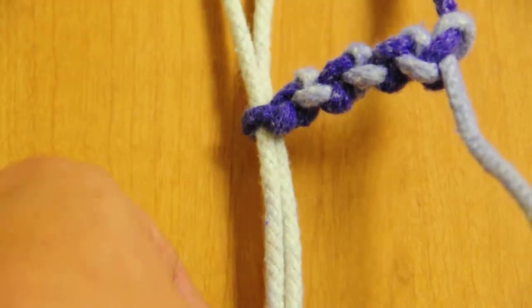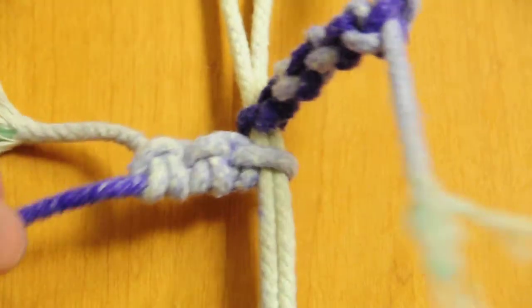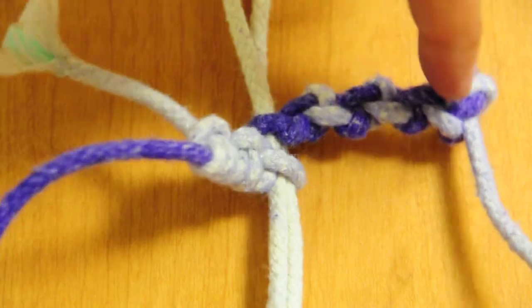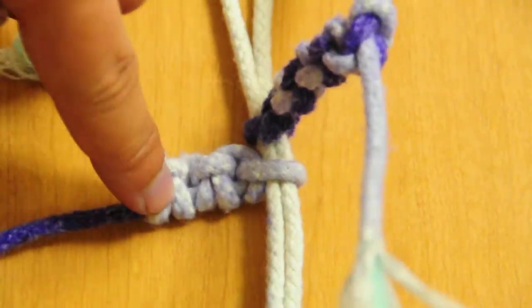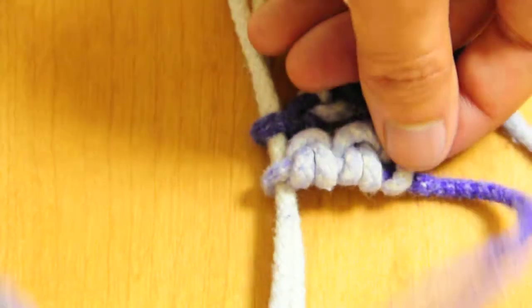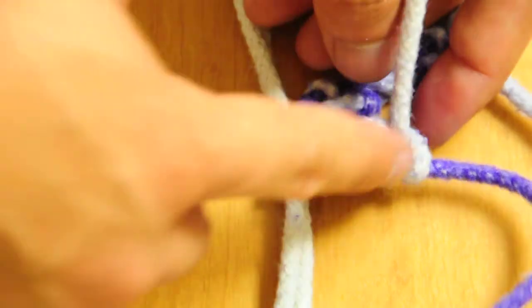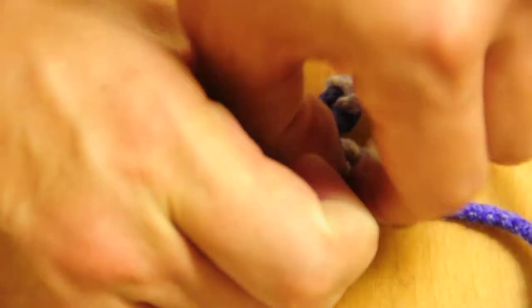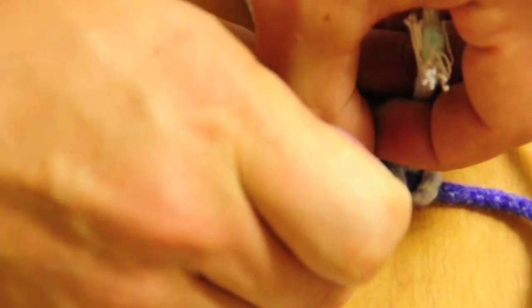Just for illustrative purposes, these are half hitches. These are square knots. And the half hitch, you can see, one strand is completely straight. All you have to do is pull on it, and the whole knot will come undone.